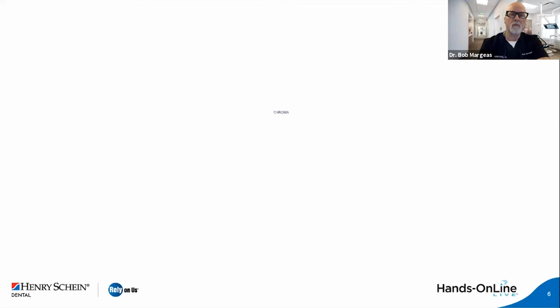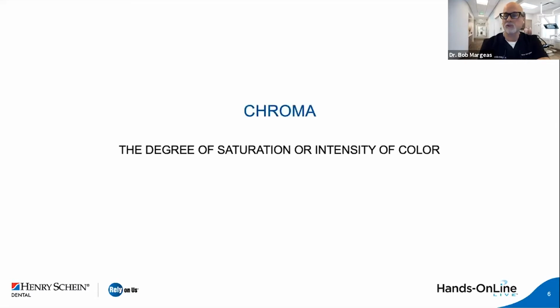What about chroma? Well, chroma is really the degree of saturation or intensity of the color. And with chroma, the way you get chroma is you either use a darker shade of composite, or perhaps you're going to use a tint to bring that chroma or intensify that color.